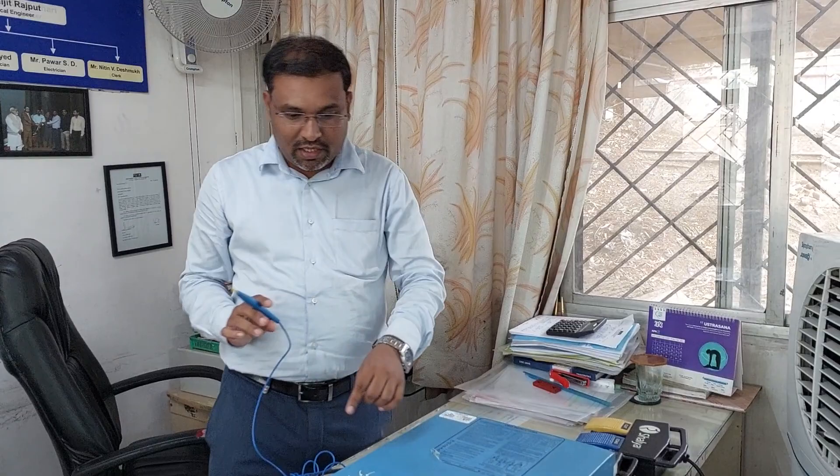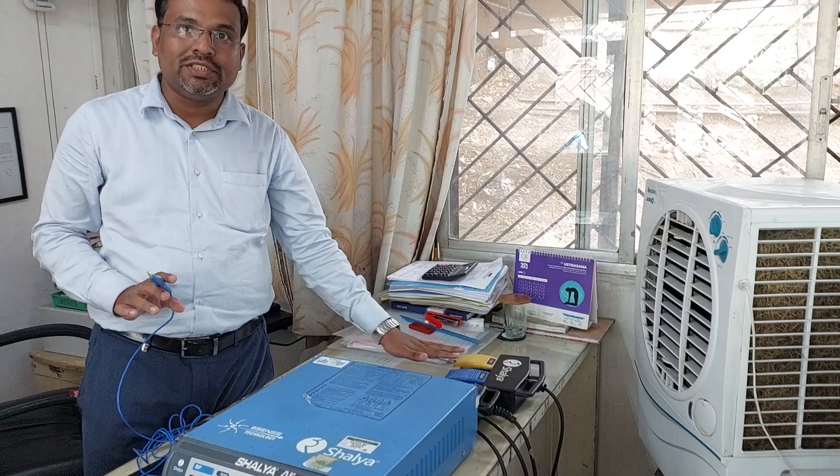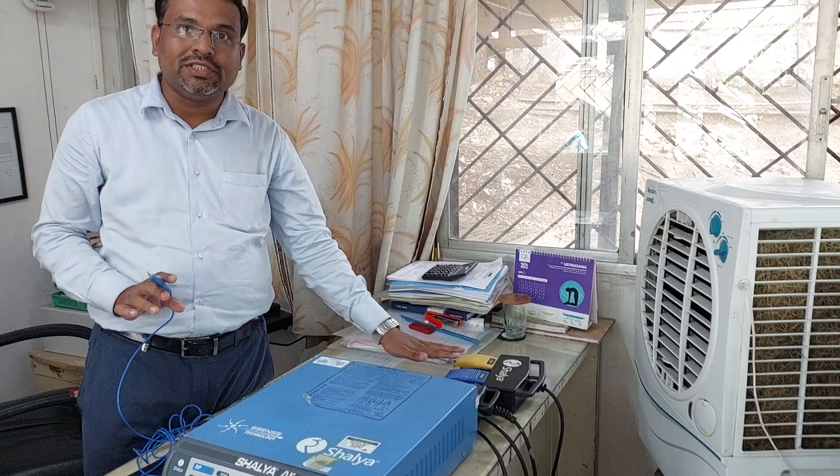To recap: first connect the power cord, second connect the patient plate and check that the alarm indication disappears, then connect the electrode, connect the foot switches, switch on the cautery, select the required parameters, and check it on the sponge. If there is sparking during coagulation, that means your cautery is working properly. Thank you.